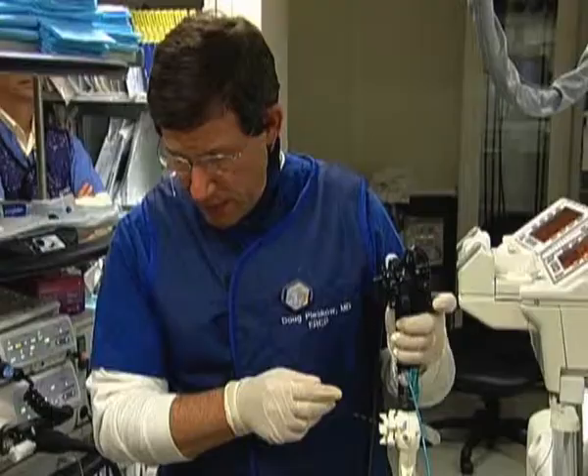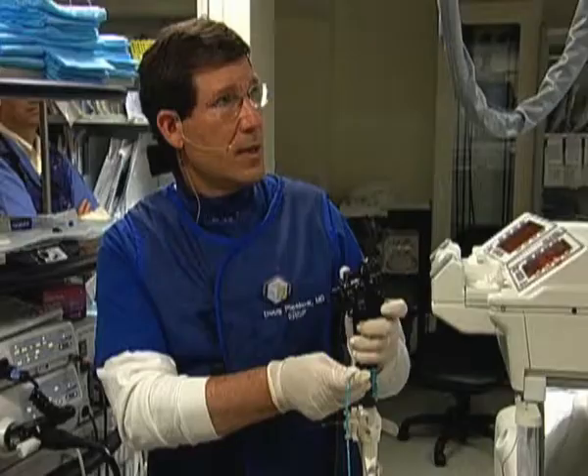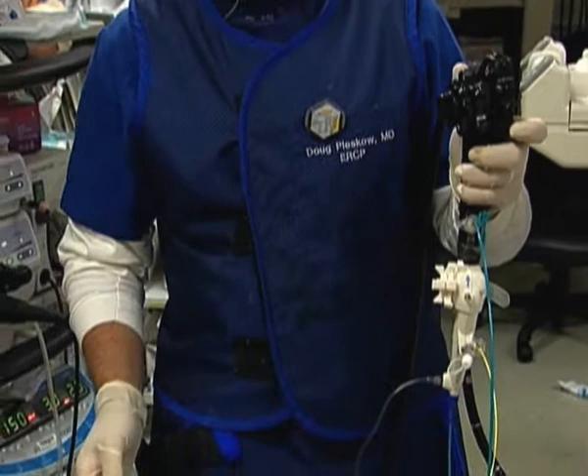Now we've come up against a stone right here and it looks fairly large. Jermaine will irrigate with our independent water irrigation to see if we can visualize this stone a little bit better. You can see that this is a fairly large stone, and there's a lot of debris within the bile duct as well. Because there's been a big sphincterotomy here, we can just continue to irrigate the duct. My plan now is to remove our guide wire from the spy scope and advance the EHL probe down through our spy scope to perform our EHL.